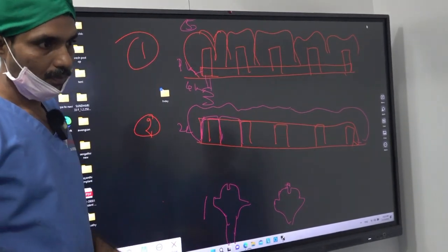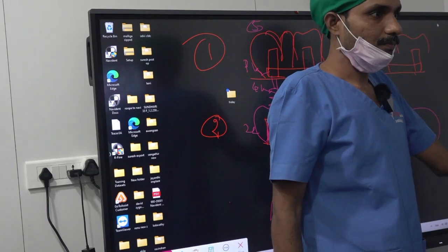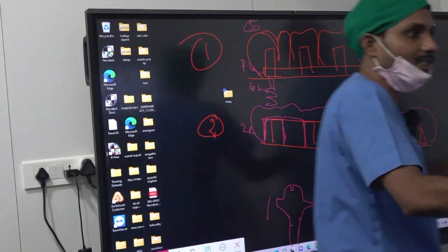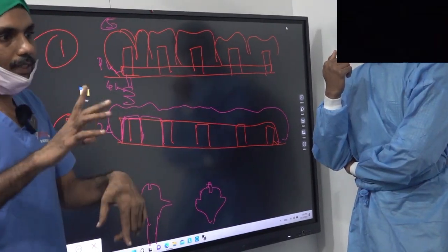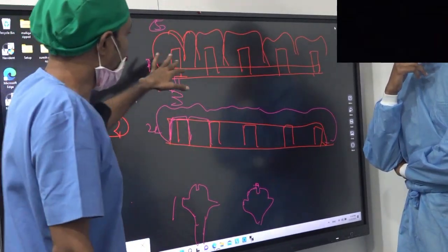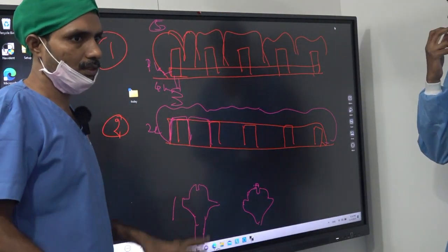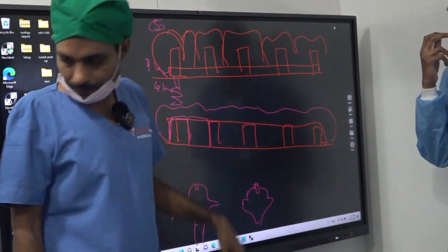See, I am holding it like this. Okay, this is welding. If I am giving a metal acrylic process, it holds like this, 360 degrees, the process holds here. But here, at only one point it connects. If the implants are all good, the welding works. There is decent bone. Inter-implant spacing also is decent.